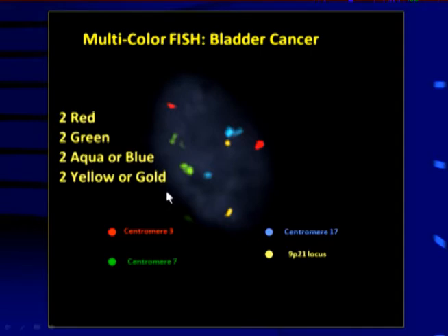We see in the FISH signals what's called a doublet, and these are normal doublets. They're still connected, so that is still one signal. And there's a doublet, and there's a good doublet, and there's probably a doublet. This does not look like a doublet, nor does this, but it is. Why? Because it's a 3-dimensional nuclei. The other part of that doublet is below the surface. This is either the north or the south pole, and so is this.